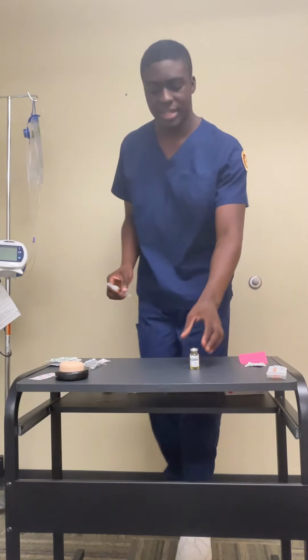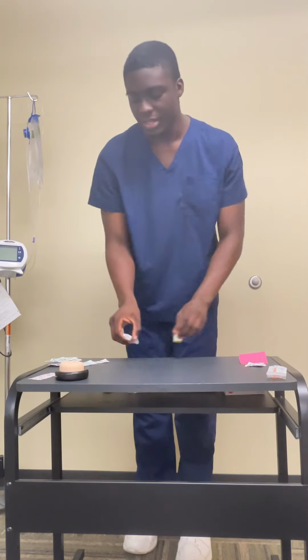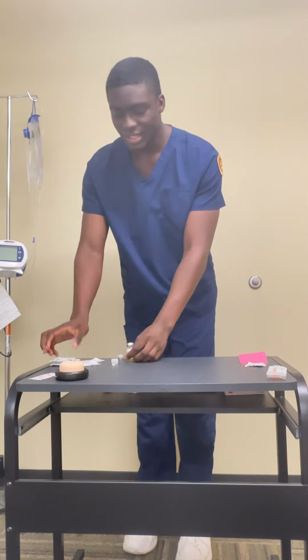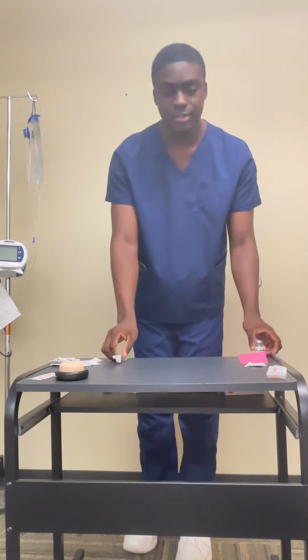And then I will go into my patient's room. We'll prep my equipment for movement. Then I will assess that I have the right medication, which is the vitamin K, 1 milligram over 1 milliliter. And then I would say, good afternoon, my name is Ginger. I am from UAM. Could you tell me your full name and date of birth? I will give my identifiers for my patient, to be sure to have the right patient.